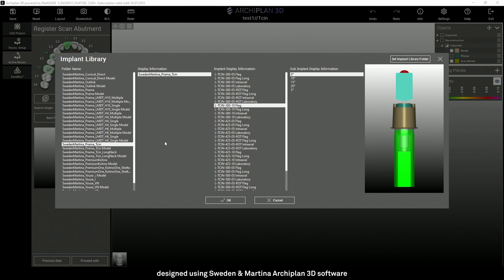Once the libraries have been downloaded, you can import them into the Archiplane software or whichever software you are using. In this case, we're going to choose the Sweden and Martina Prama TCIN library. In the second column, I will indicate the diameter of the implant, the mm of closure of the T-Base on the neck of the implant, and the type of scan body that I'm using.